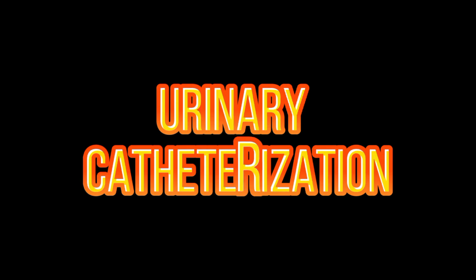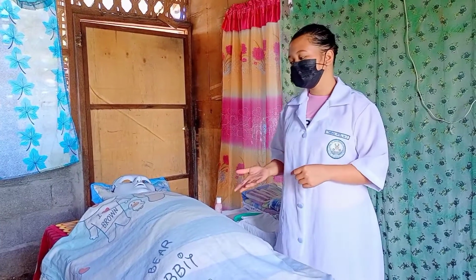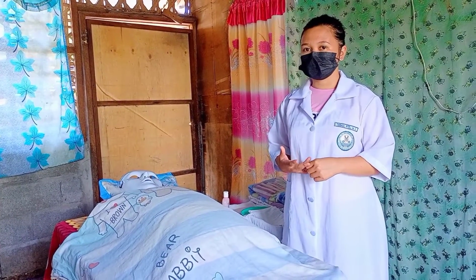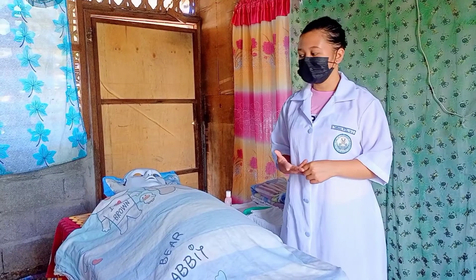Urinary catheterization is done to relieve discomfort due to bladder distension or to provide gradual decompression of a distended bladder. So first, introduce yourself briefly to the client. Identify the client using the agency's protocol. Explain to the client what we are going to do, why it is necessary, and how the client can participate. Also discuss how the results will be used in planning further care and treatment. And also perform hand hygiene.